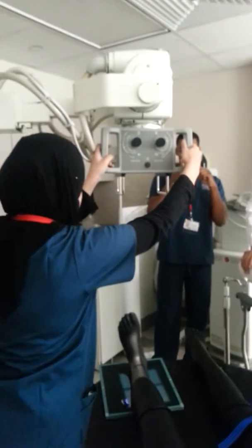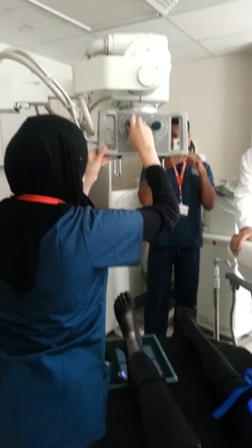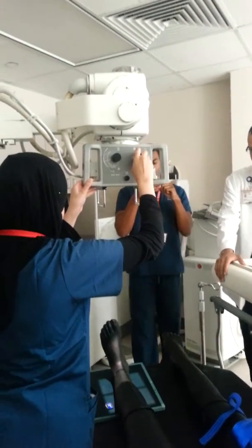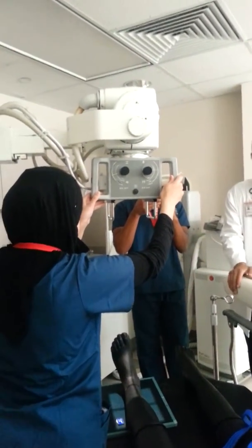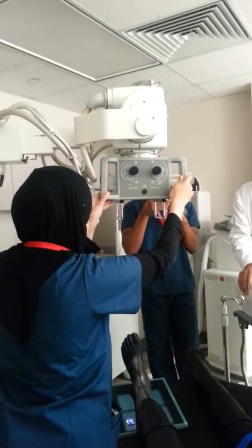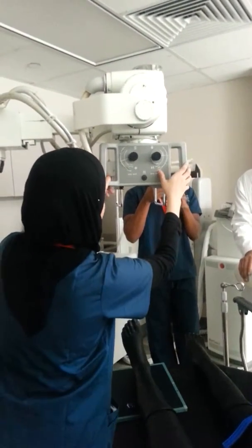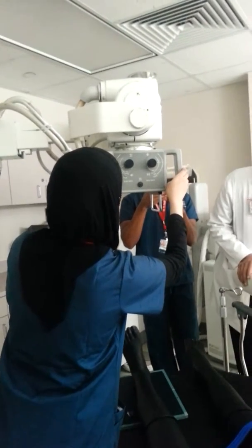There you go. What size cassette are you using? Okay, so she's setting the scales. 24 by 30 at 100 centimeters. Measure the SID.